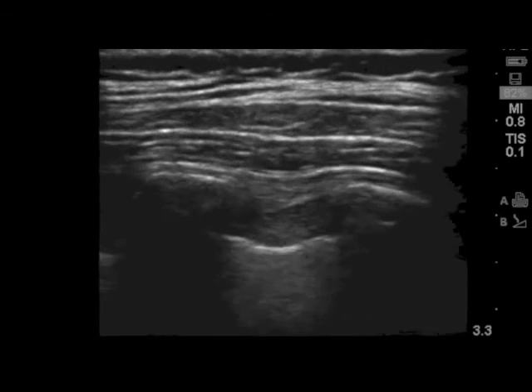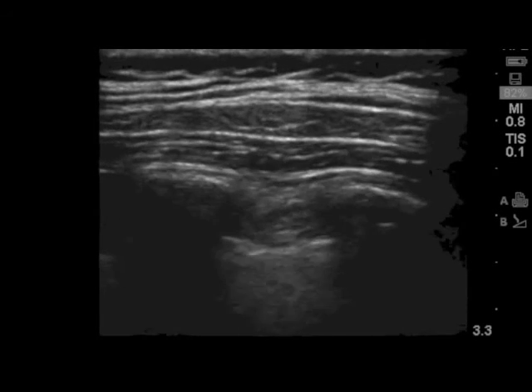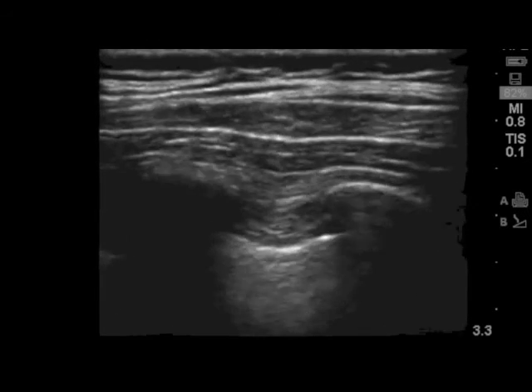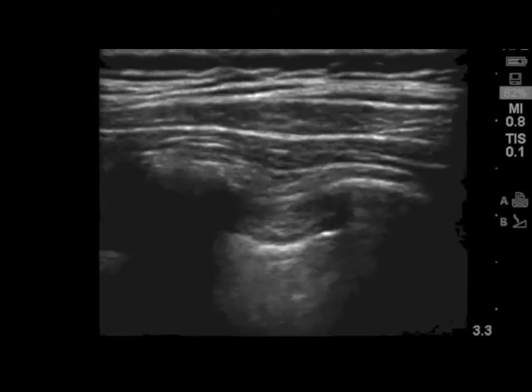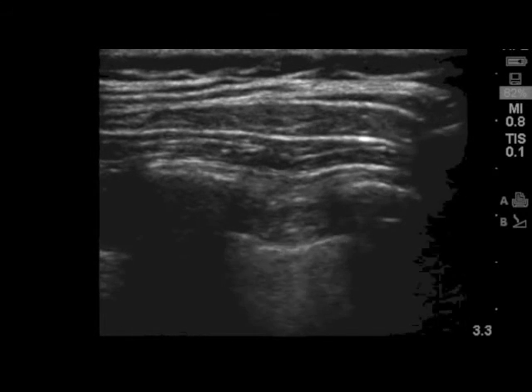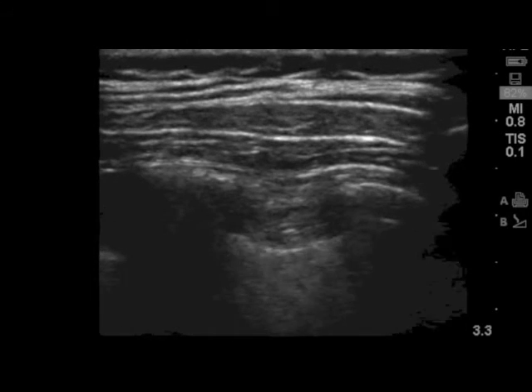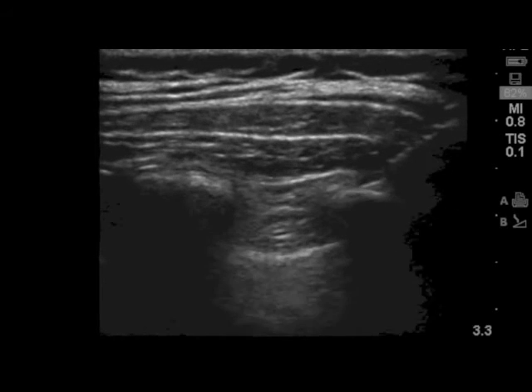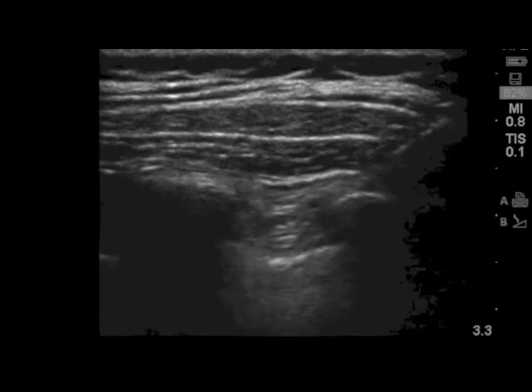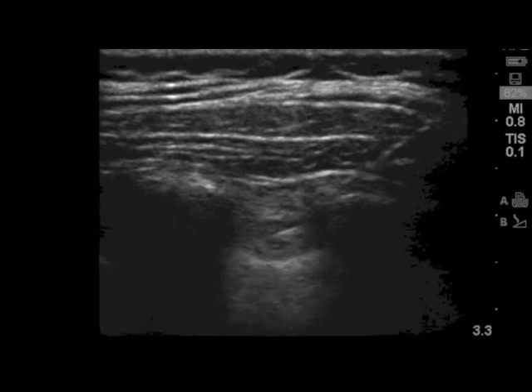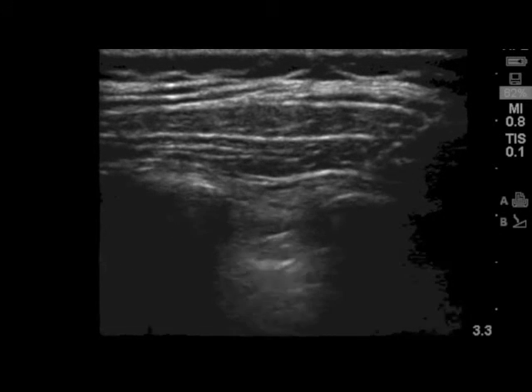This video demonstrates a thoracic paravertebral block. It's important to identify the landmarks, which are the transverse processes on either side of the screen with the bony dropout beneath them, and the bright white pleura with the lung beneath it. The needle is entering from a right to left direction, and as it is advanced you will see it pass the transverse process, walk off the process, and advance. It's helpful to have an assistant inject some local anesthetic to help identify the tip of the needle.